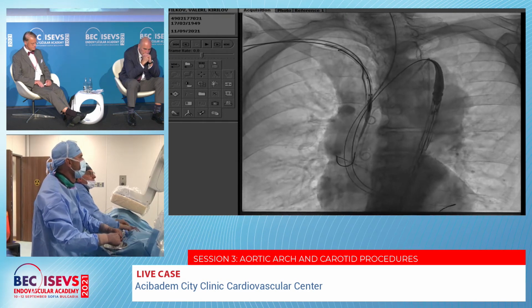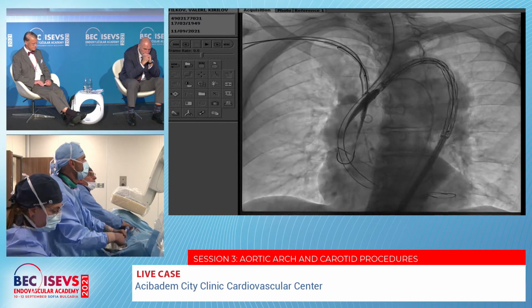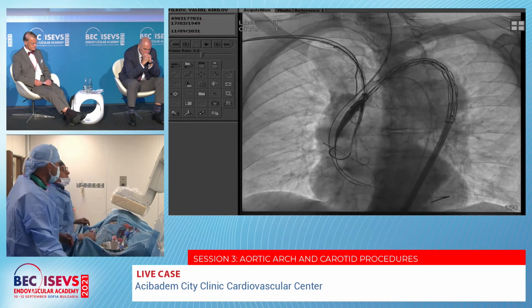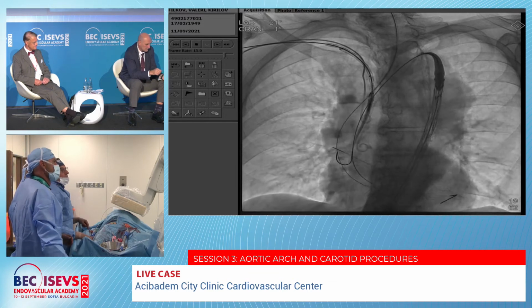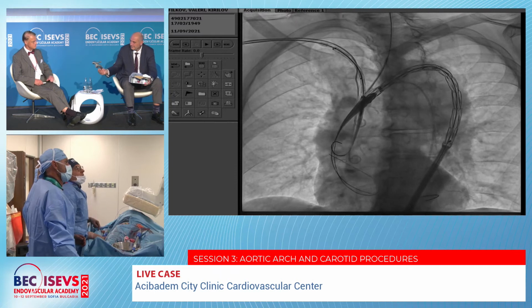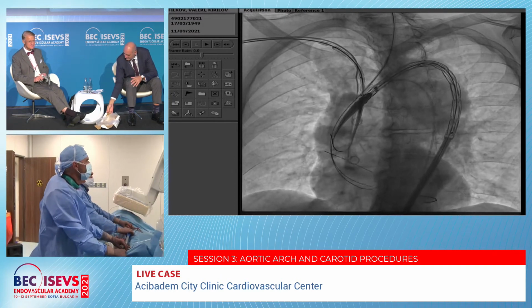This is crucial. You saw probably, because of the excellent wire, the aortic endograft went quite smoothly. So we have to precise now the level of the Bentley.